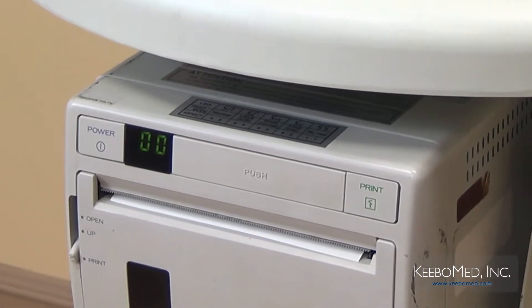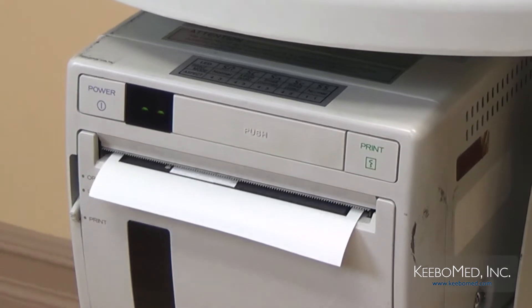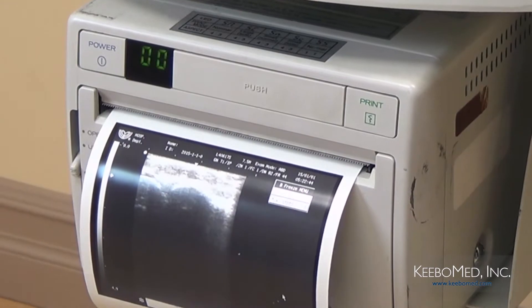In step number five, adjust the parameters for the video printer accordingly. The printer is now ready to print. For more details, refer to the user manual of the video printer.